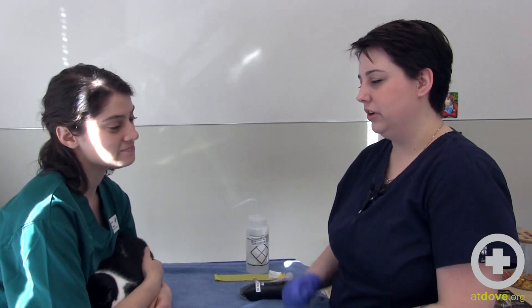I'm Kelsey. I'm the blood bank coordinator at Dove Lewis, and today we are going to draw blood on Luna in preparation for her donation.